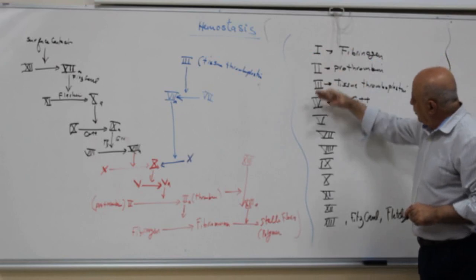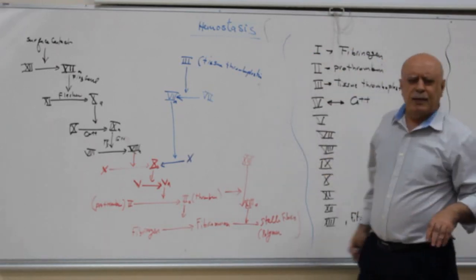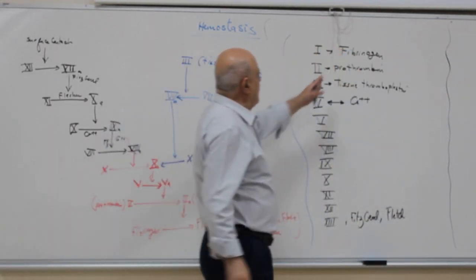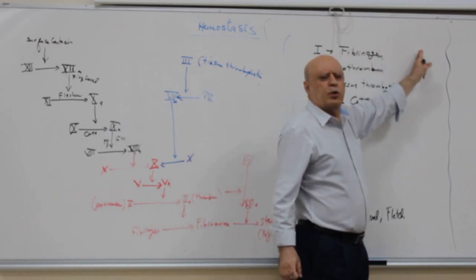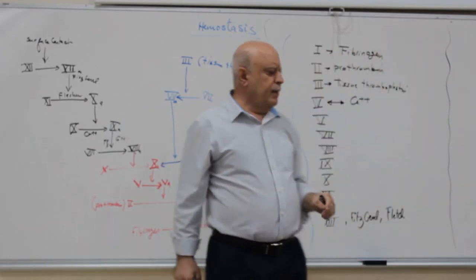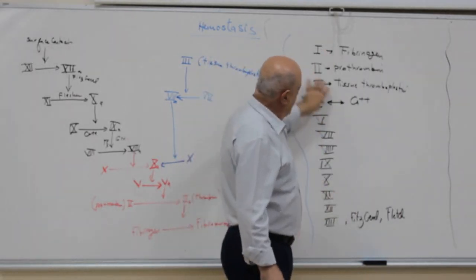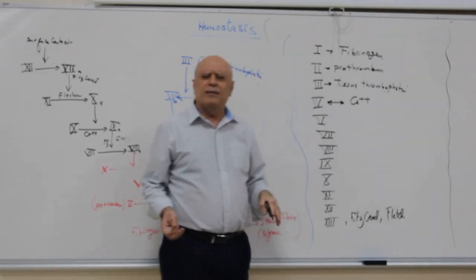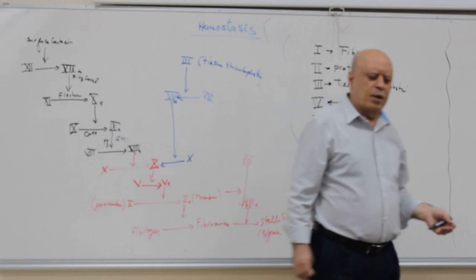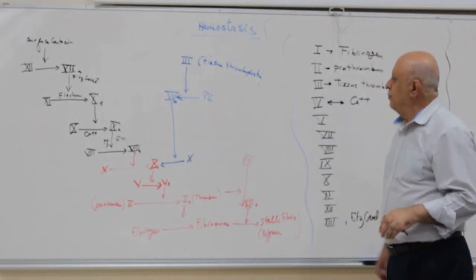And all these factors are circulating in the plasma all the time. They don't cause fibrinogen to clot or turn into fibrin. Otherwise, we will die. The reason they don't is that they are in the blood and we don't clot because they are circulating in an inactive form. Only we can activate them while we have a blood clot.